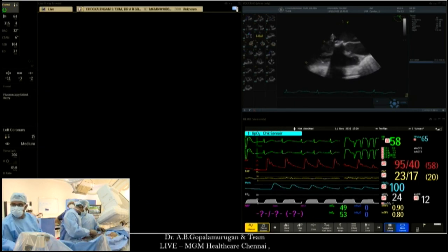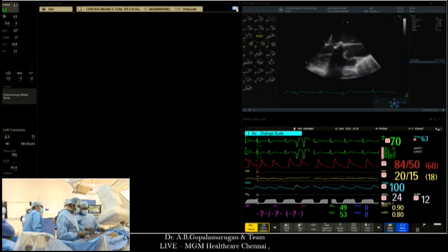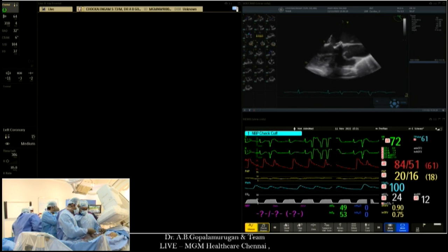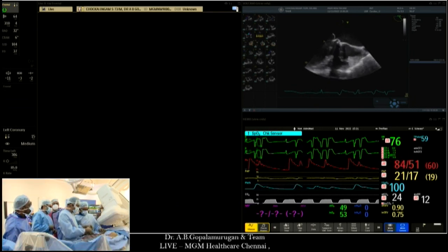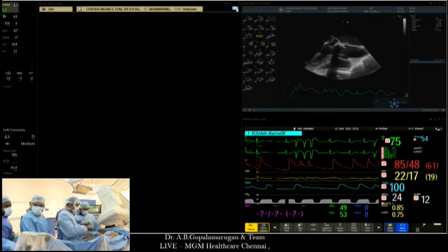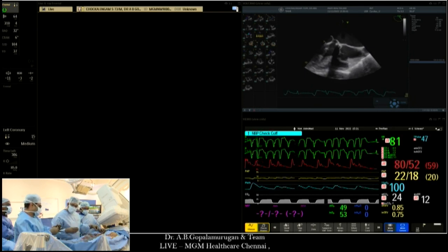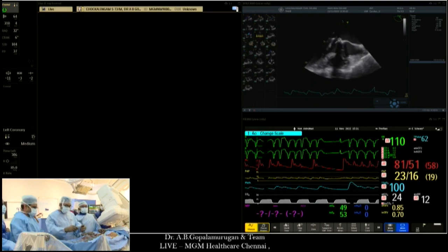What do you think the mechanism of bioprosthetic failure is here? Here is just a Biocor, a porcine tissue, never known to last more than 10, 12 years. If you look at all the Biocors, I'm not aware of any that has lasted much longer. So Biocors, porcine, go away. Nowadays, of course, we would go for a non-porcine, perhaps a bovine tissue. I think the longest tested bovine tissue now, Resilia tissue, seems to be very promising, but only time will answer. We have only 7-year data thus far. We did the first Resilia mitral valve also last year. So we'll see.